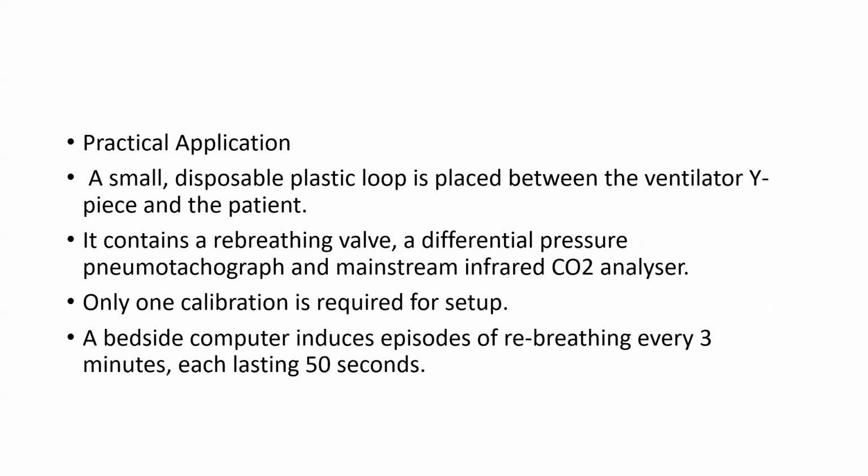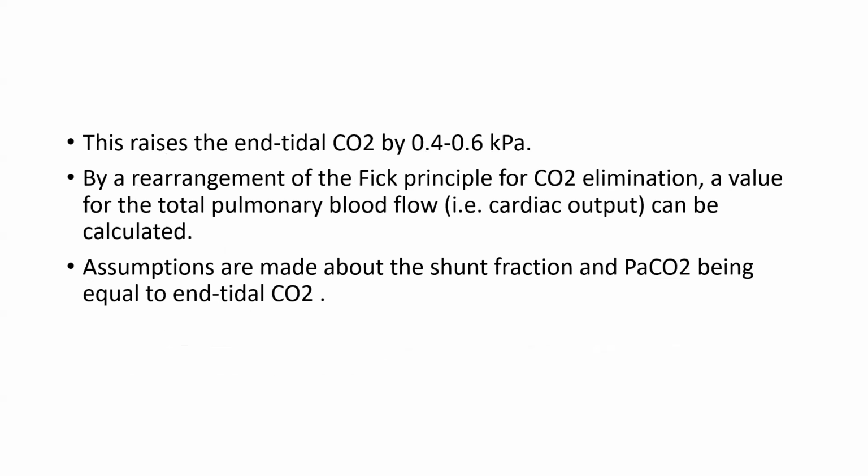It contains a rebreathing valve, a differential pressure pneumotachograph, and a mainstream infrared CO2 analyzer. Only one calibration is required for setup. A bedside computer induces an episode of rebreathing every 3 minutes, each lasting for 50 seconds.